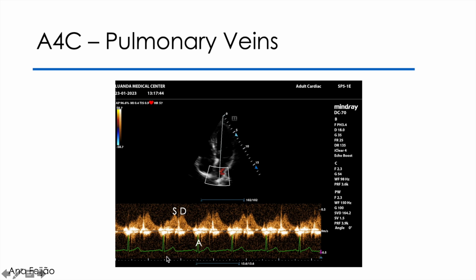Systole begins at the beginning of the QRS and ends at the end of the T wave. Diastole goes from the end of the T wave to the beginning of the QRS. Not forgetting that the atrium contraction phase corresponds shortly after the end of the P wave.